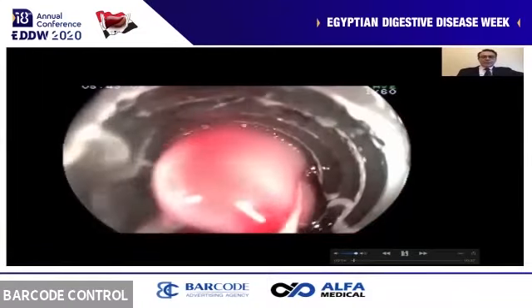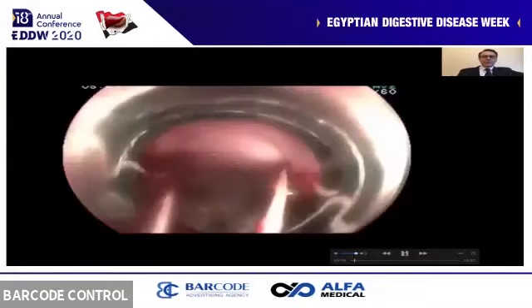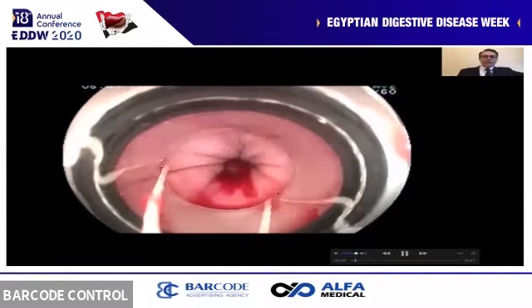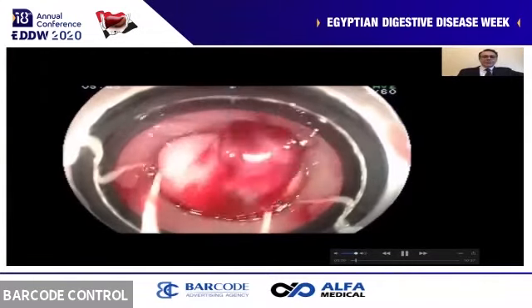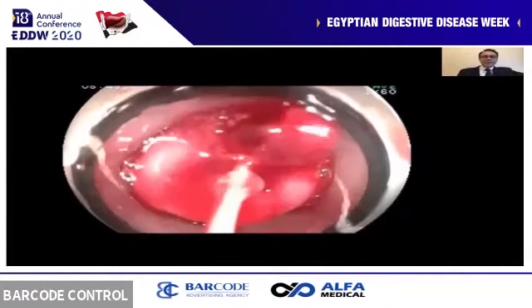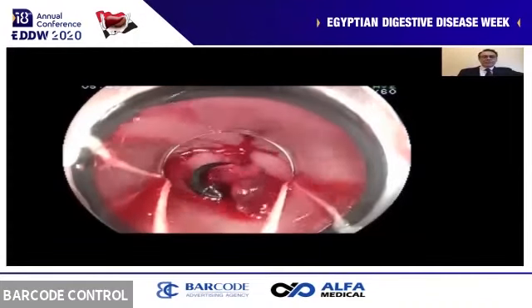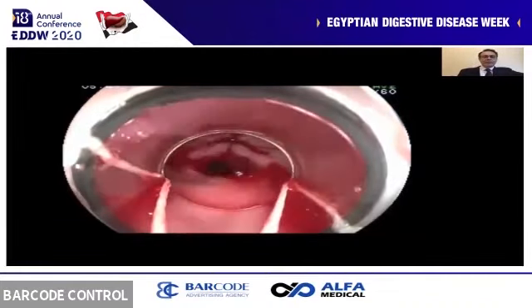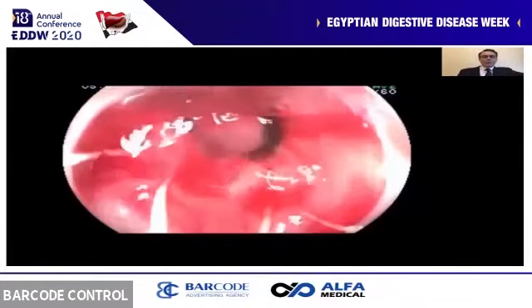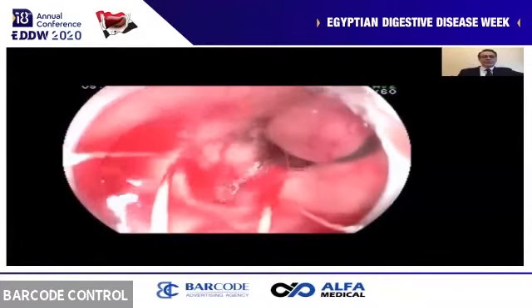In this situation, it's not clearly described in the literature how it should be treated. In this case, there was a bleeding 2 weeks after a previous banding. I tried to band the bleed inside the scar, but the tissue was hard and the band slipped. I did place the bands below, trying to decrease the blood flow to this site, but there was still bleeding. And even if it didn't look very abundant, the narrow esophageal lumen quickly became full with blood. So it was a bit difficult to identify the very specific site of bleeding.